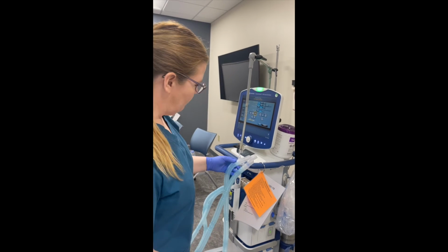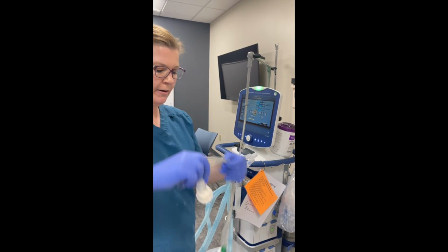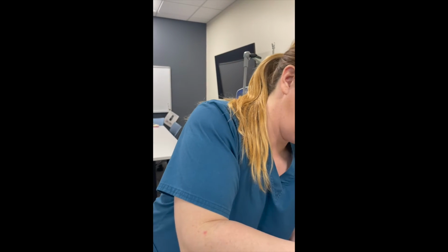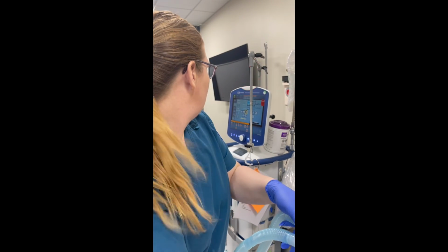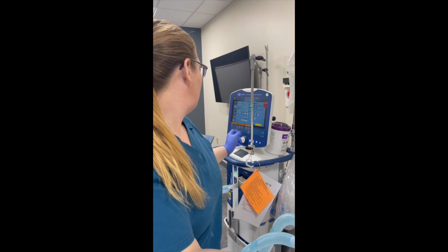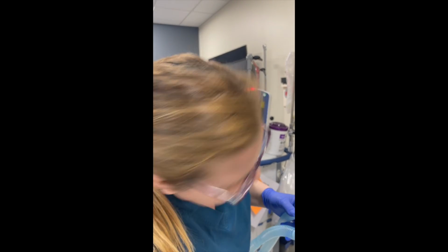So at this time, I'm gonna go ahead and set up my HME and my Ballard. Connect them to the patient. So we'll go ahead and start ventilating.